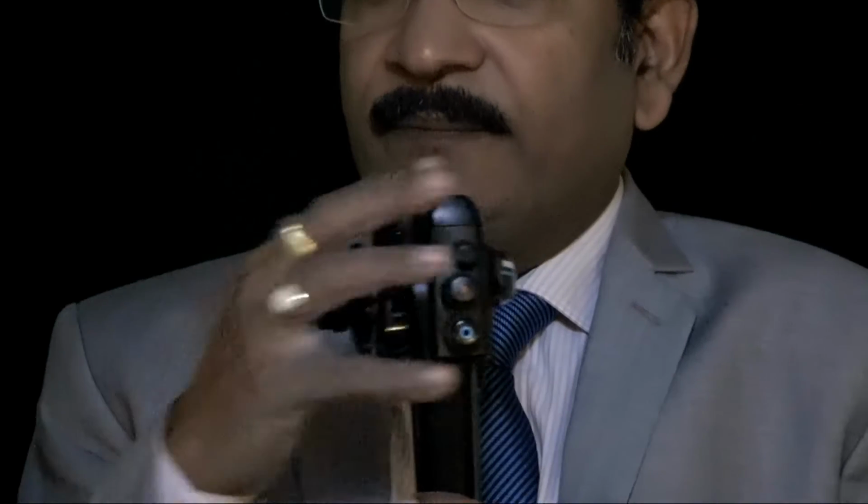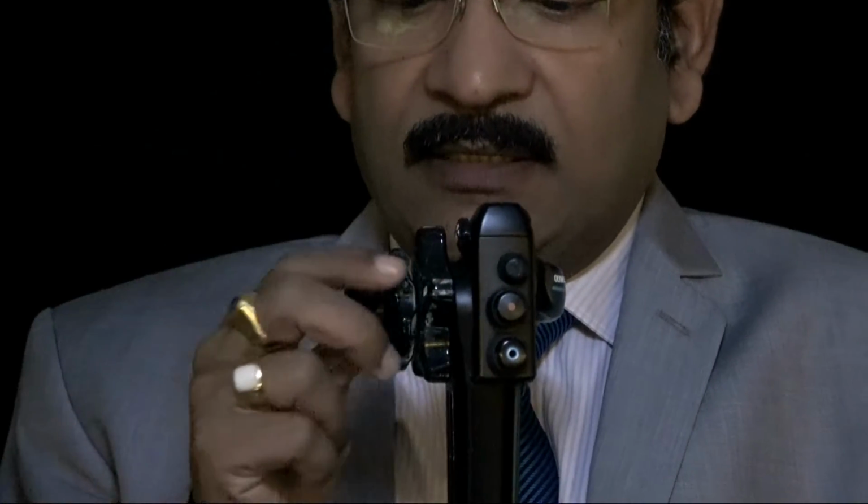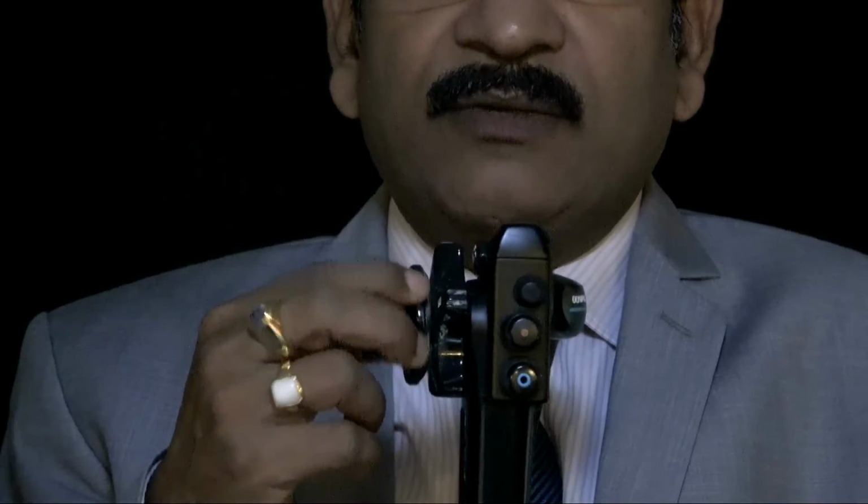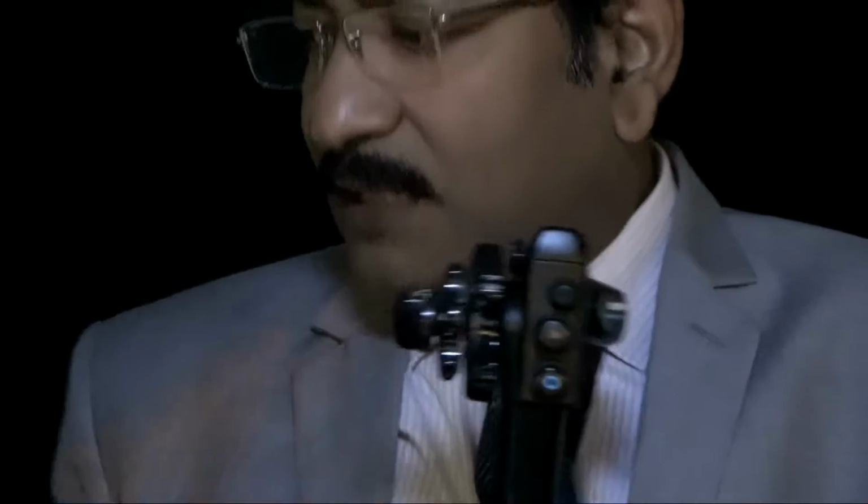It was demonstrated, but I am going to demonstrate it again right now, and the basics we will demonstrate to you. So how the endoscope works and what are the different parts. This is called the control unit, control panel, and it has two wheels. This is a larger angulation wheel and this is a smaller angulation wheel. The larger angulation wheel is used for up and down. This is for up and down.